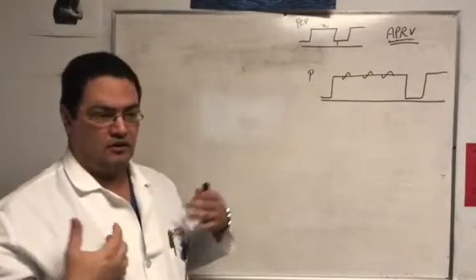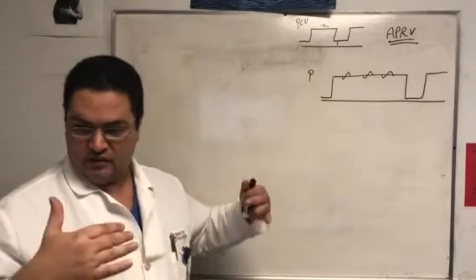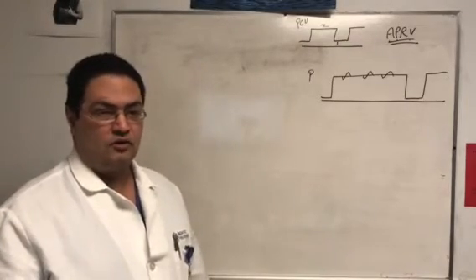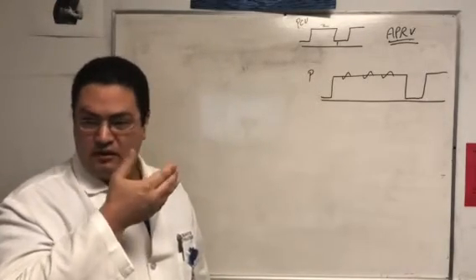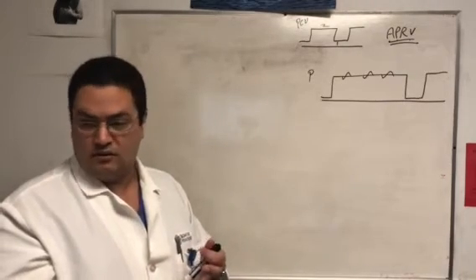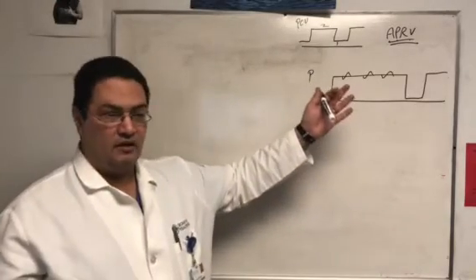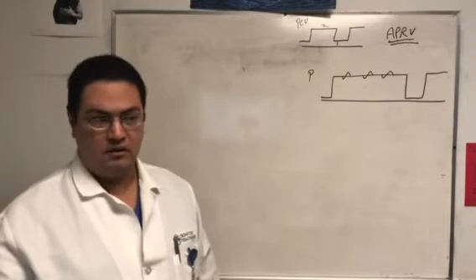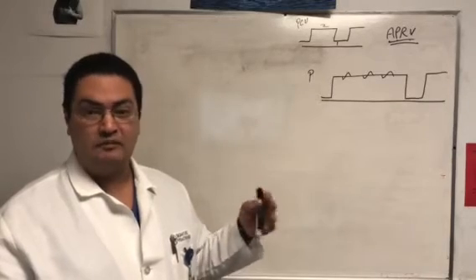So if you're awake or you're not paralyzed and you want to breathe, it's 2 seconds. Nobody wants to hold themselves for 2 seconds without breathing on top of an inspiratory, especially if the patient is sick and tachypneic. So they want to breathe, and they feel suffocated because the vent is not assisting them or even opening a valve for them to breathe on their own. This one here allows them to breathe on their own. So despite having obnoxious-looking settings, it actually requires less sedation than pressure control. So I'm gonna say multiple claims to fame for this mode.